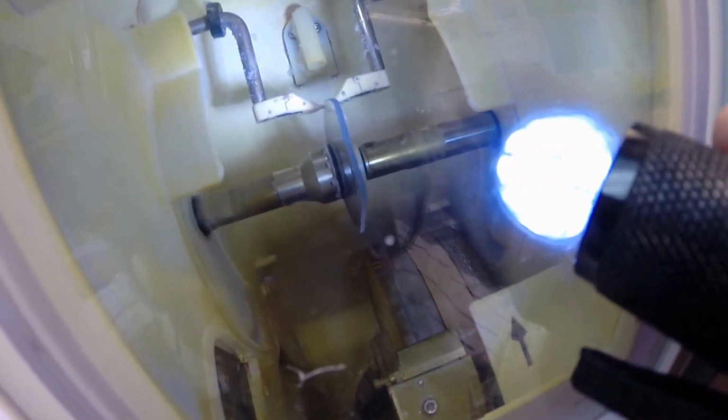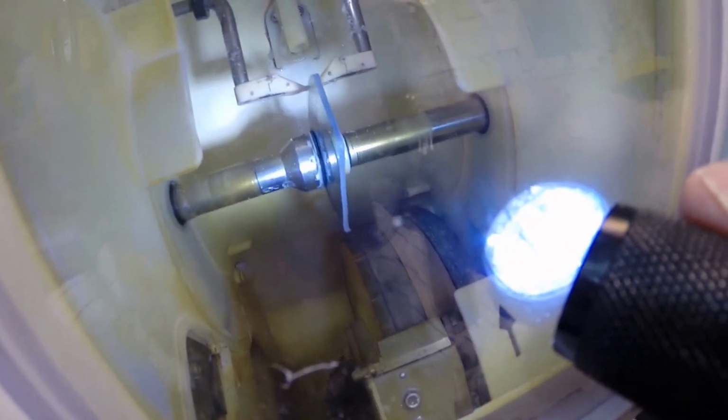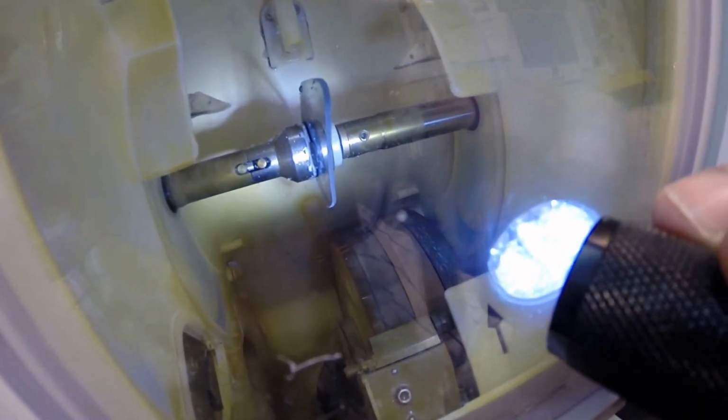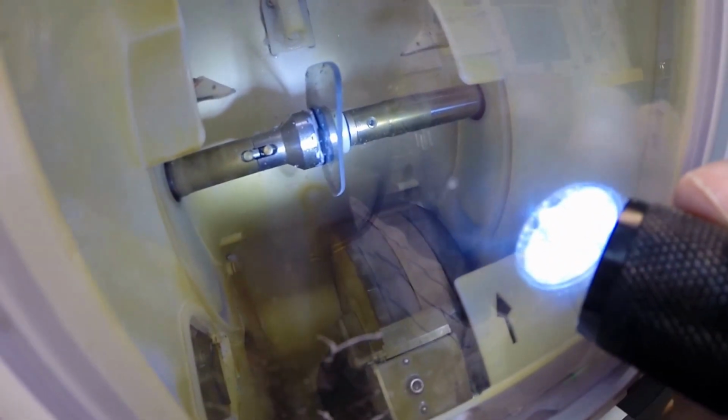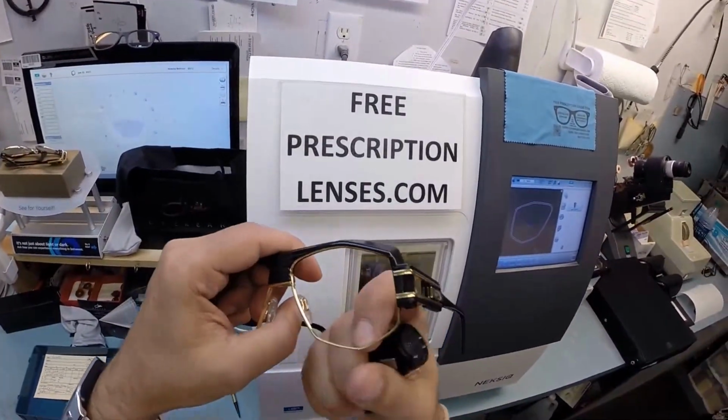So now it's just double checking again where to place the bevel. If you notice, your lens is completely flat like a nickel. If I were to take it out now, it would stand up on the counter on its own. In just a moment, it's going to drop down onto the bevel wheel to get the knife-like edge cut into the side of the lens so it stays inside the bevel of the frame.